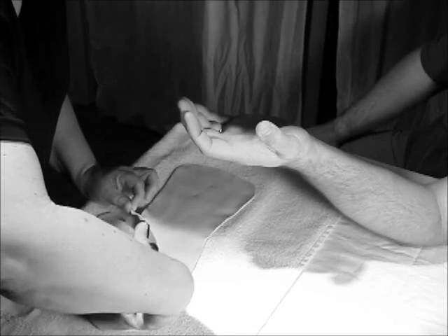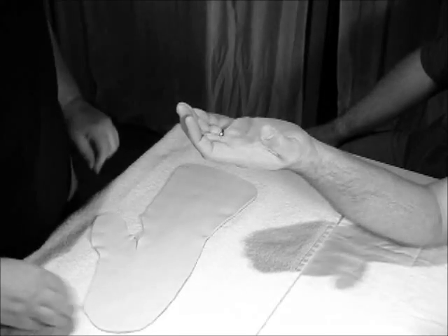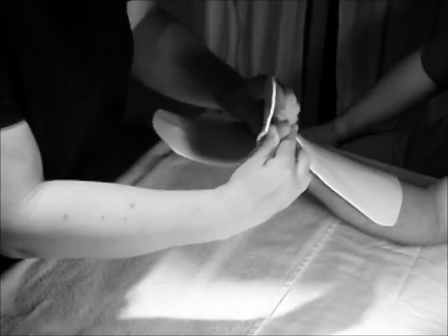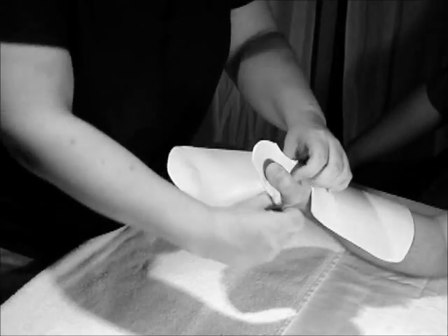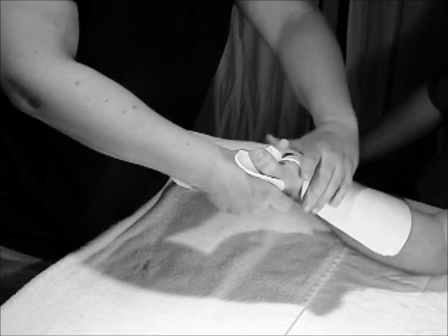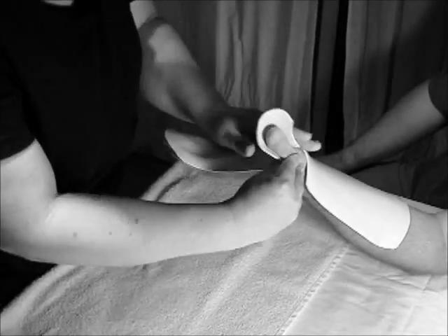And normally the doctor would put a bulky on if he's sending you down to the clinic. And so we would just put the splint right over the bulky with a little stockinette on it. And you can see the thumb is jumbo gigantic, so we don't need it to be that long, but that's okay because I can just trim that off.